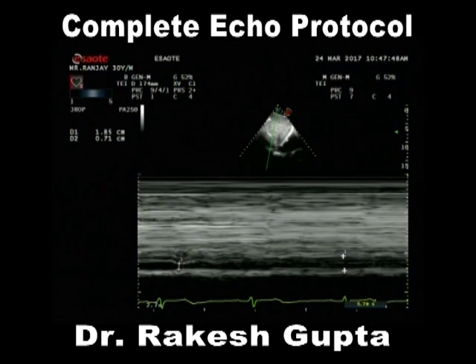And once you go back to your country, those places are really humid, especially in summer. You will find the majority of your patients are dehydrated. Look at their IVC, their IVC would be only 10. Those people will be even more dehydrated whom we are asking for a stress echo because they have been fasting for 2 to 3 hours. In one of the religions, we have to keep fast the whole day, not even drink water. And in extreme summer, we are sweating a lot. What happens to hydration? Try this IVC, and this is worth publication of a paper back in your country.